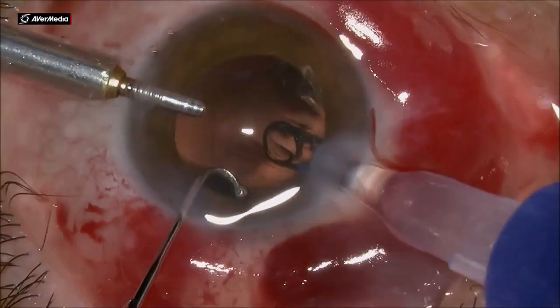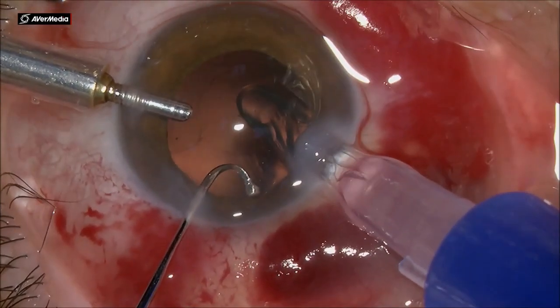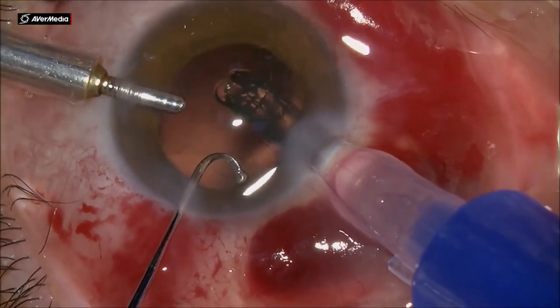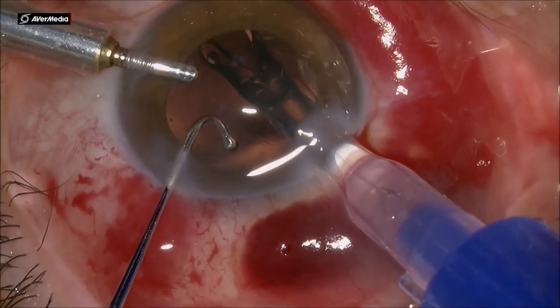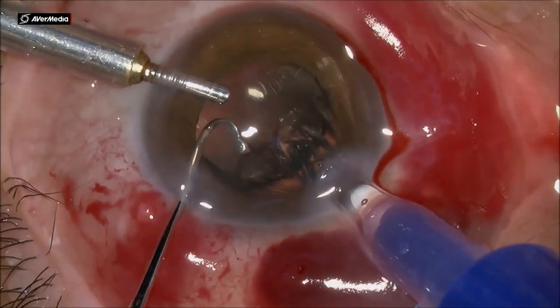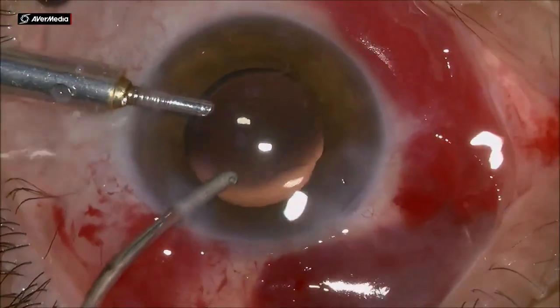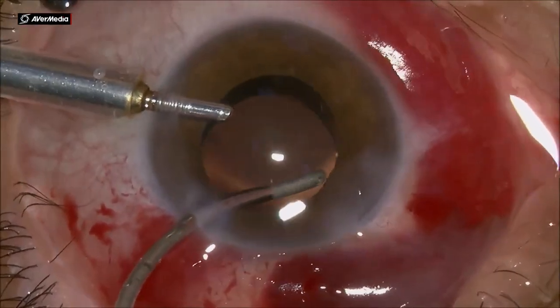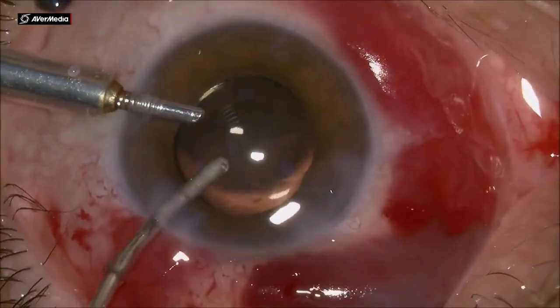Injecting the trifocal IOL inside the bag is a very easy task to do, and then I'm using an aspiration cannula to aspirate the cortex, and then rotating a little bit the IOL inside the bag and placing it into position, centering it a little bit, and that's the end of the case.